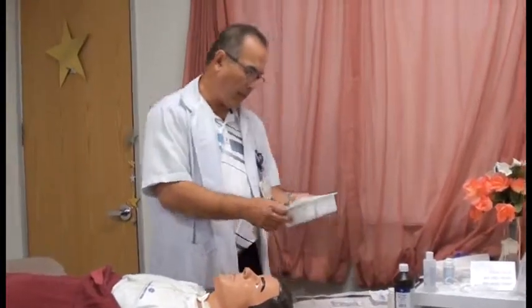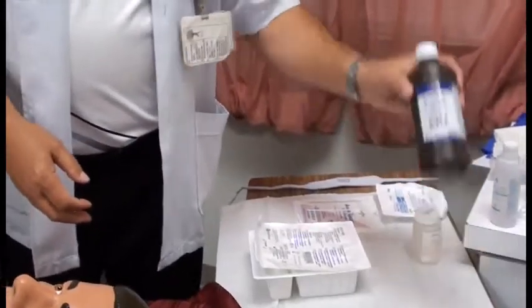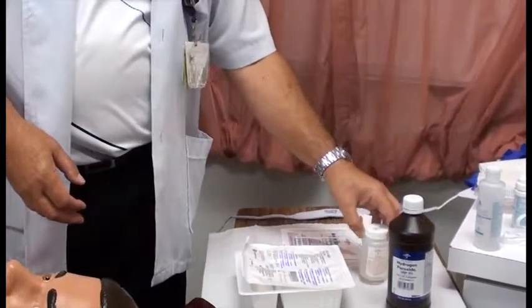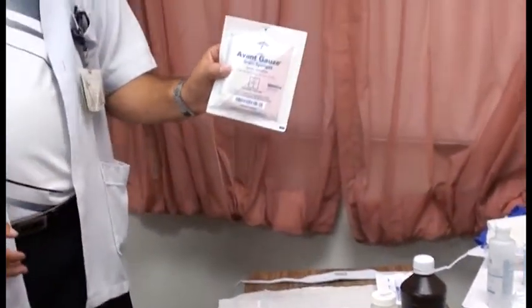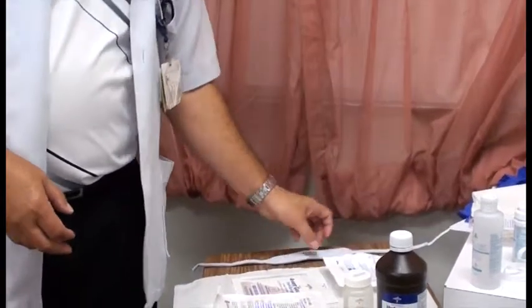We have the tracheostomy cleaning kit here, hydrogen peroxide, normal saline, extra cotton tip applicators, drainage sponge, suction catheter, and the trach tie.